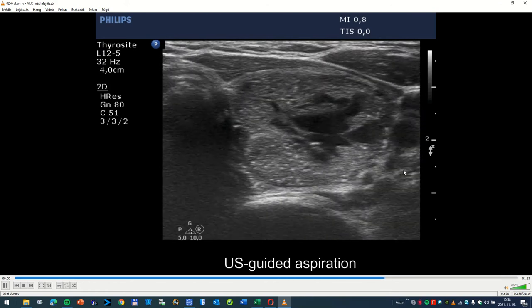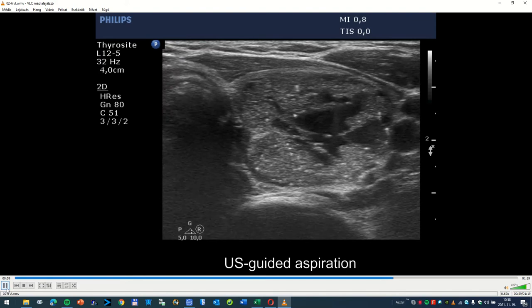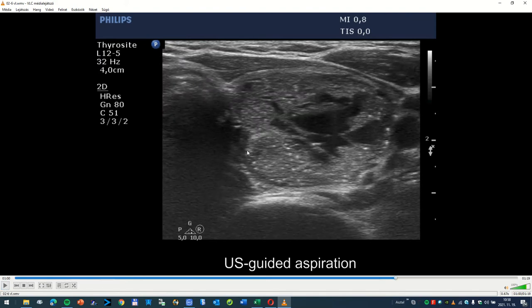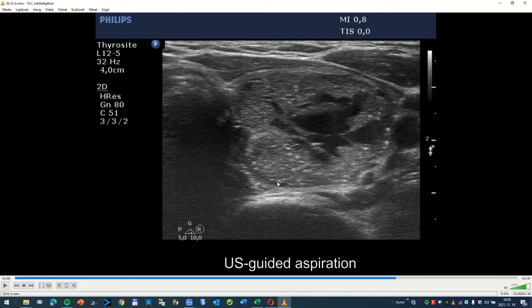The second part of the aspiration — I stopped the video. If I had two choices to state whether this is a micro-calcification or not, I would clearly state that these figures are not micro-calcifications, but I am not fully sure about this. This solid part is a candidate for aspiration cytology. It is very likely that these are back wall figures, but it is not a clear-cut situation.